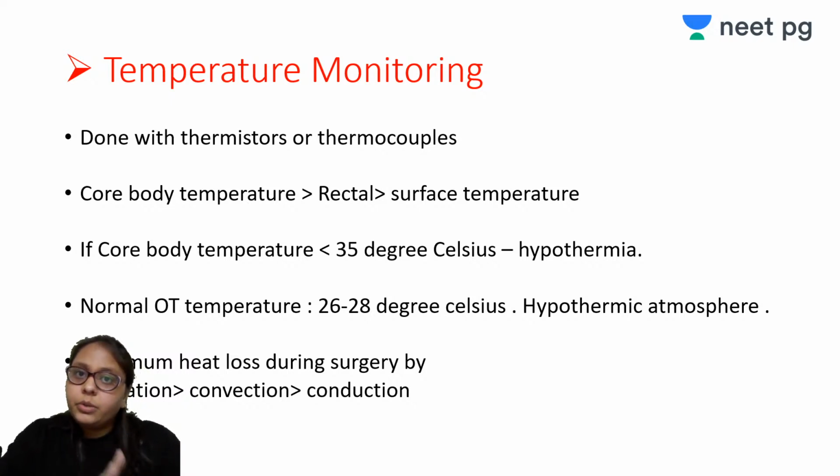Okay, so the pulse ox, it is telling us about the oxygen saturation of the hemoglobin. We discussed the various principles, uses and sources of error. Now coming to the second topic for today, that is temperature monitoring. Why is temperature monitoring important?